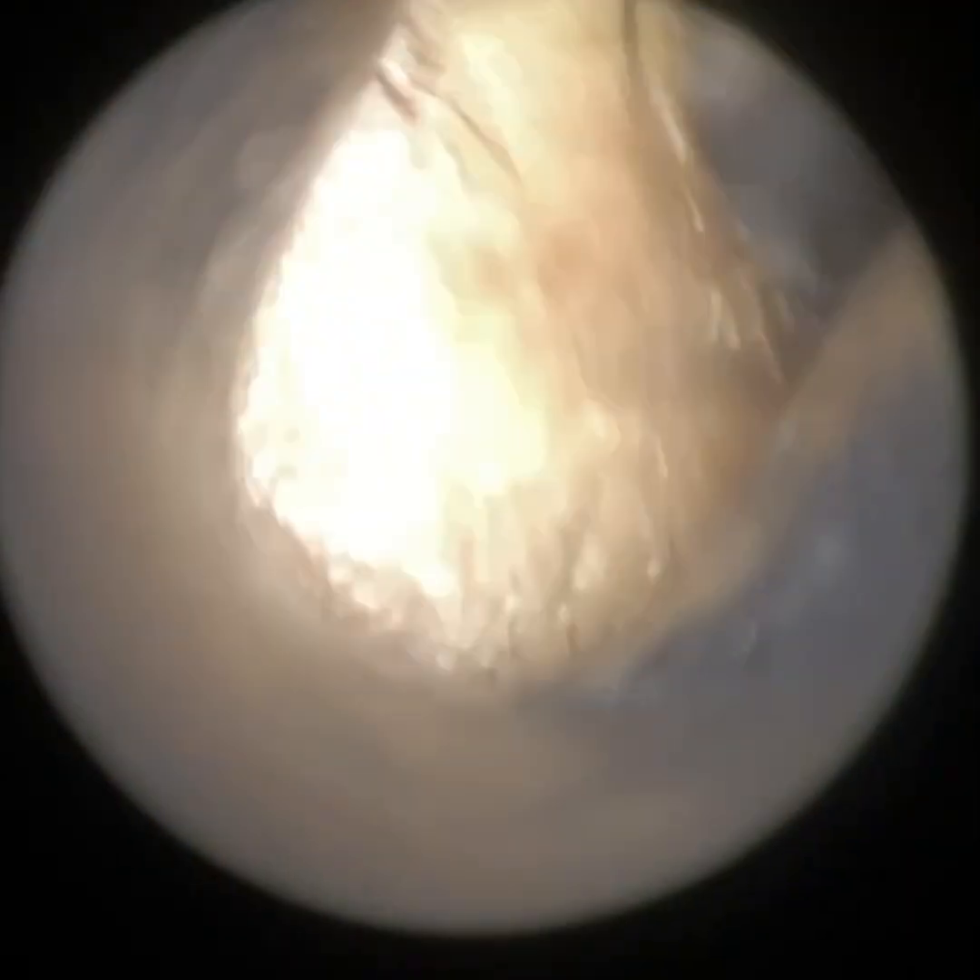We have here a screaming and crying child who attended today with her parents for a bilateral earwax removal. The initial examination was taken with the iClearScope endoscope, and as you can see, it was near impossible to not only get a view of the ear with the iClearScope, let alone to perform the procedure.